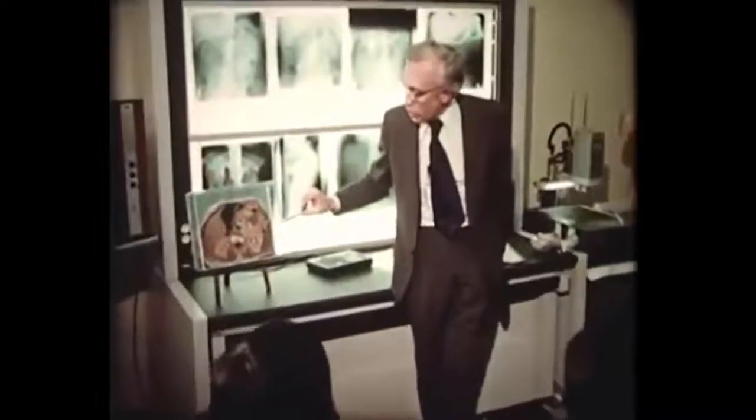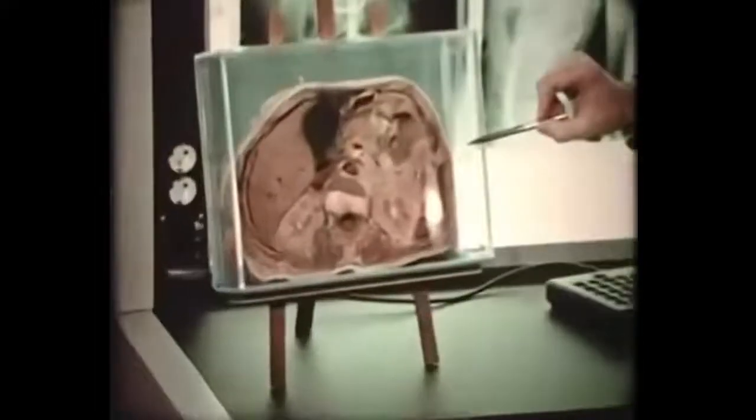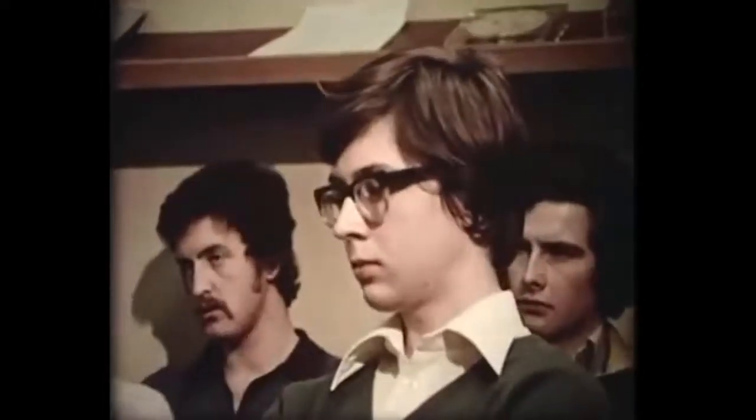If you do that sufficiently often and in a sufficient number of times, one can compute the information about the structure through which the x-rays have passed. And we can deduce information about the ability of those structures to absorb x-rays and then reconstruct them by computer methods. What we'd like to see is a horizontal cross-section of the body like this. And this is at a level where the pancreas would be expected to be.